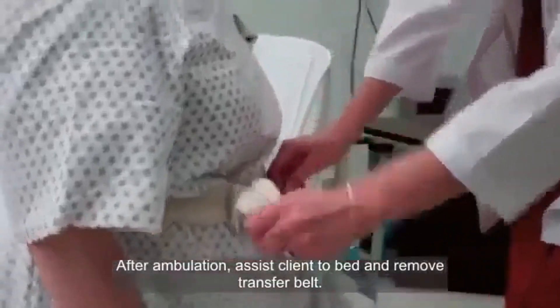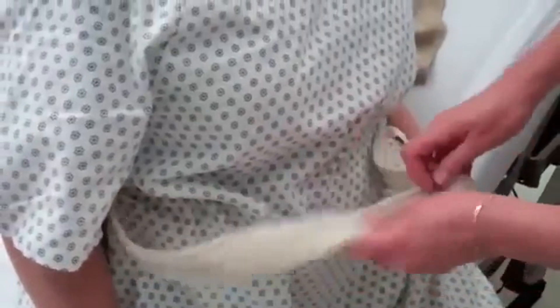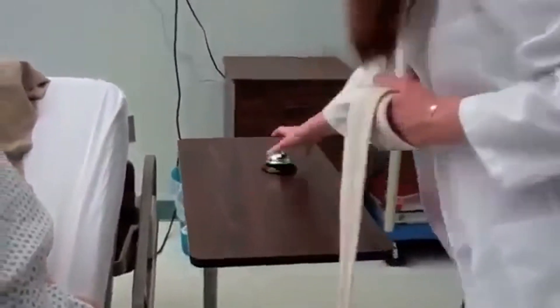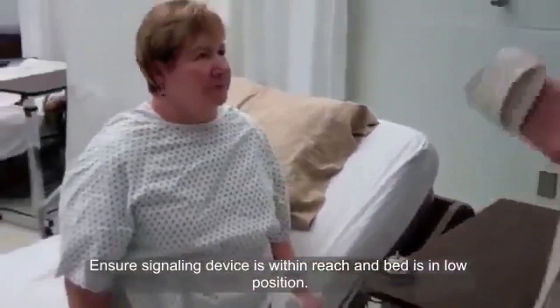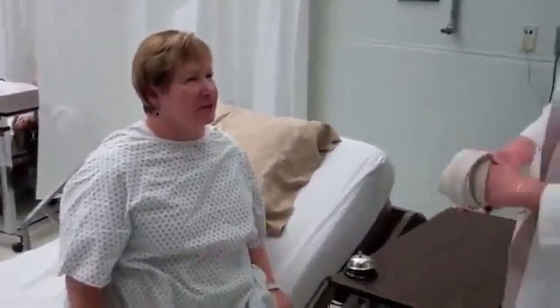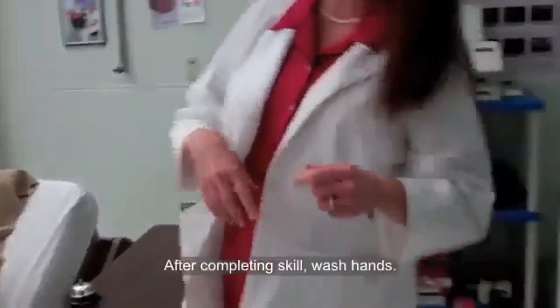Let me remove the belt. Would you like to sit here on the side of your bed for a while? Sure, that would be fine. Okay, great. All right, ma'am, here is your call light. Should you need anything, please call me. You are all right? I am fine, thank you. You did a great job. I am just going to wash my hands and I will leave.